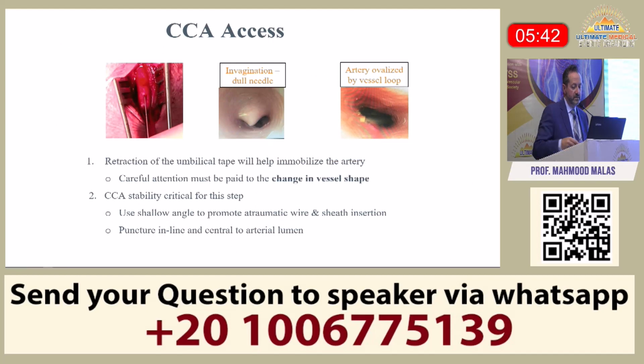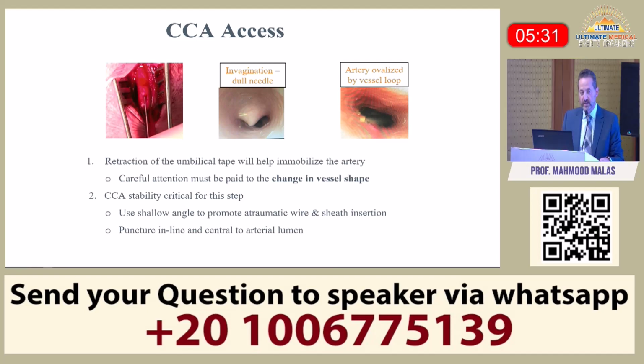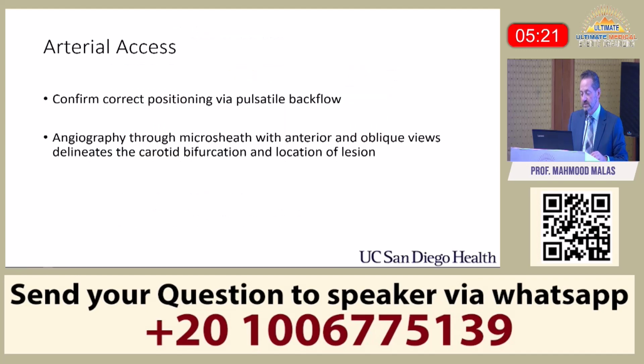Be careful. The rep will tell you to pull a lot on the carotid, but then when you're doing this, you can ovalize the carotid, and then the needle will go in the back wall, and then the wire will dissect. And I hear Dr. Abrahma talk about dissection a lot with TCAR. The biggest pitfall of this procedure is to avoid causing a dissection. Once you get the access safe, the rest is easy.